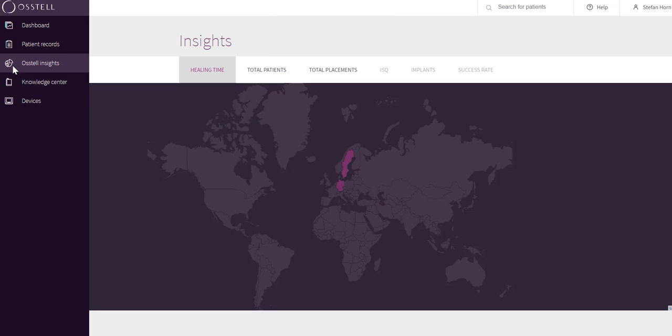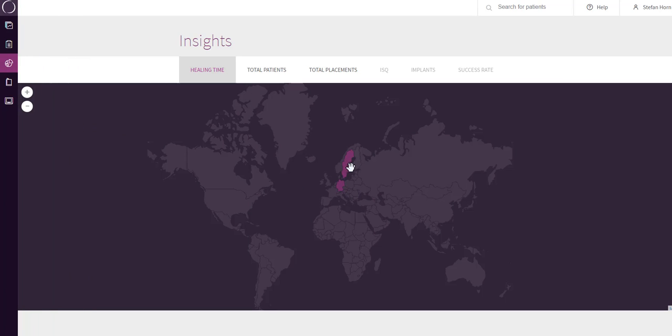Austell Insights is an analytics tool that collects implant treatment data from Austell Connect users all over the world. It enables you to view and benchmark global anonymized statistical data for the different parameters listed on the screen. As default, the whole map is shown. You can also click on a country on the world map to get specific data for that region. The analytics for the gray parameters are still under development, therefore not available yet.